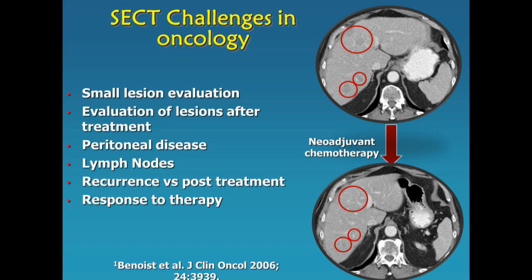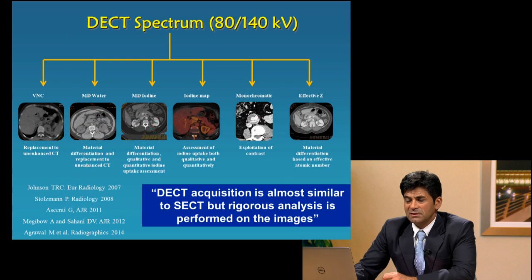And after treatment has been given, especially these novel targeted therapies or organ-directed therapies, the changes that we encounter are different from what used to happen with the cytotoxic therapies. So these are creating problems for single energy CT.